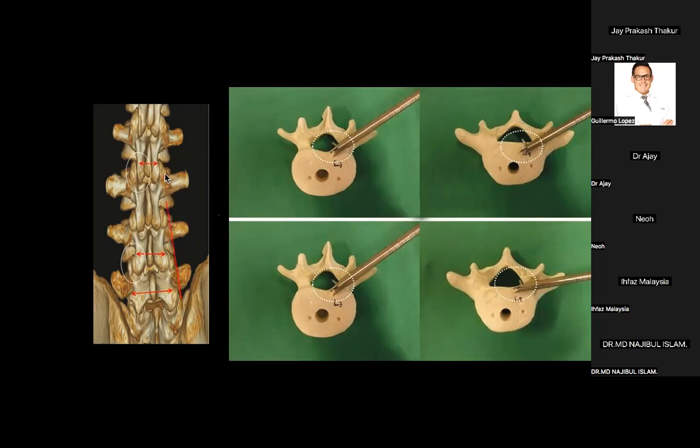At this level it is here. Understood? So it makes a lot of difference. At 10 centimeters for L5 S1, or maybe L4 L5, you are inside the disc. At 10 centimeters at L2 L3, you may be here, inside the canal.